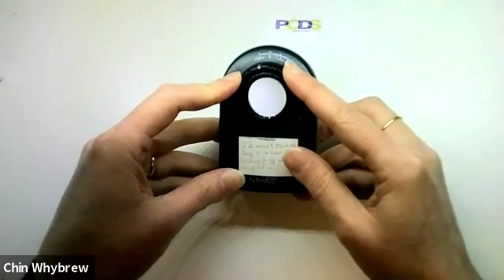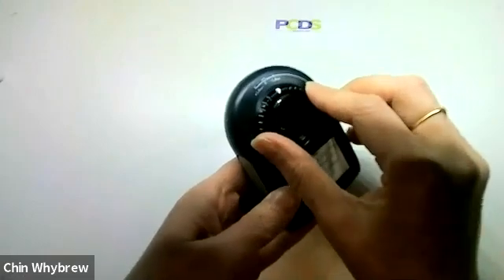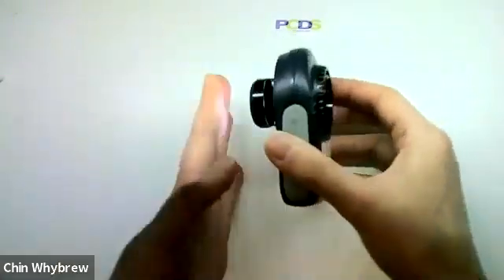You'll notice that there's a marker at plus one millimetre and minus one millimetre — that is how much you can adjust it and still rest it on the skin and the end plate will stay extended.